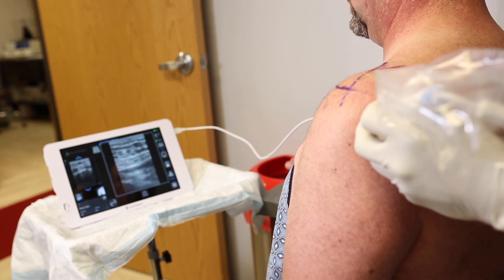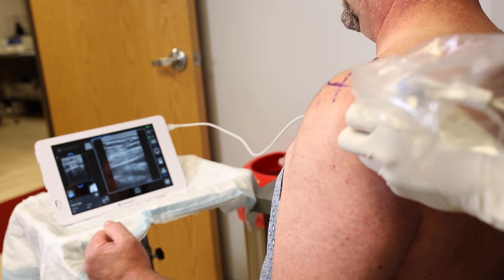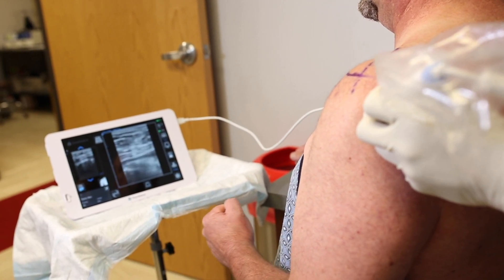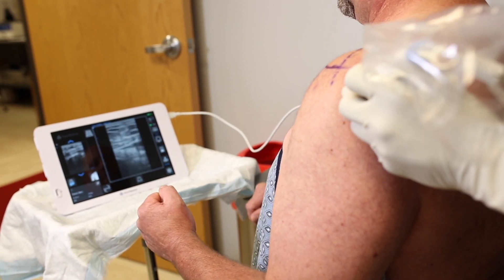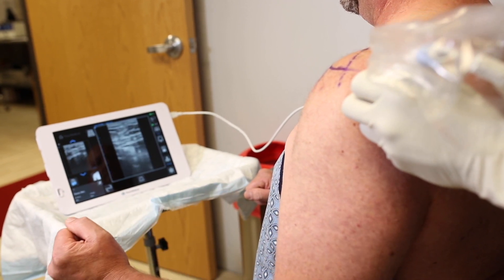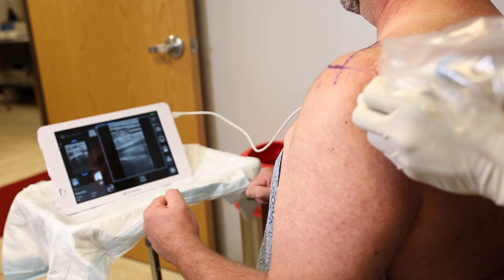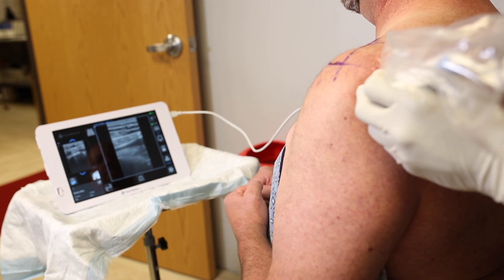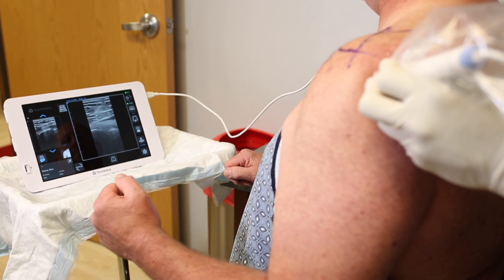Now on the screen we're getting the typical posterior glenohumeral joint view commonly used in shoulder ultrasound. We can use dynamic motion — I can have my patient internally and externally rotate as we look. This patient is very experienced with ultrasound and can even hit a button on the transducer to adjust depth. We're getting a dynamic view to confirm that the transducer is directly over the glenohumeral joint from the posterior approach.